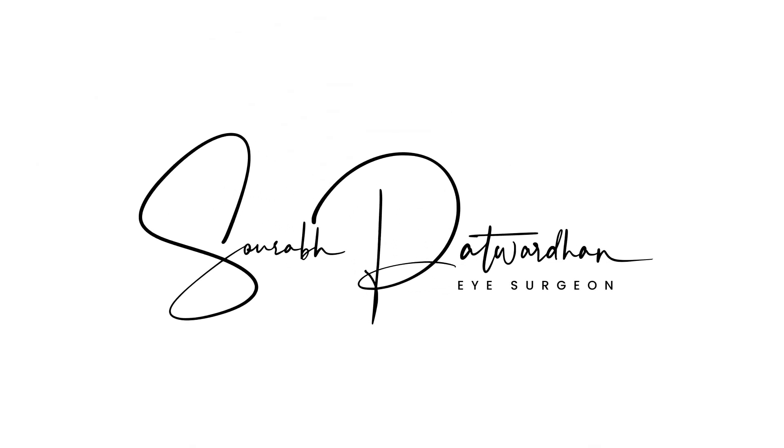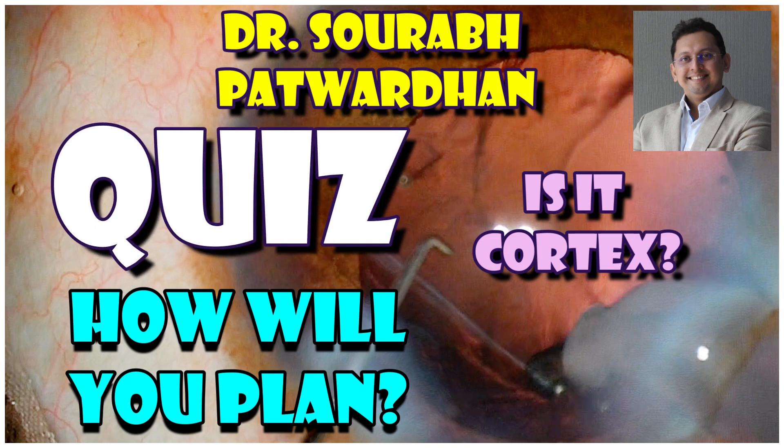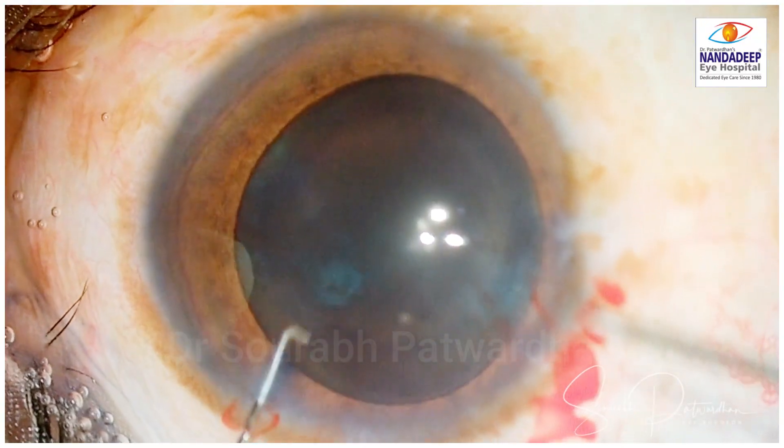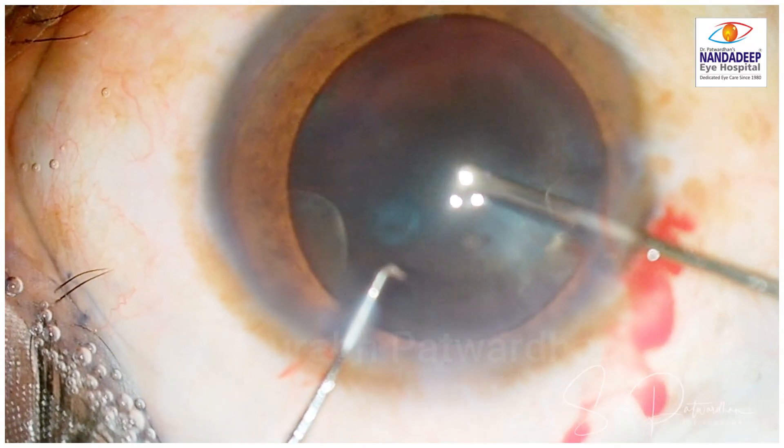In this video, I will be showing a very interesting case and there is a quiz. How you are going to go ahead in this particular case — this is a brown-black cataract which I am going to tackle.